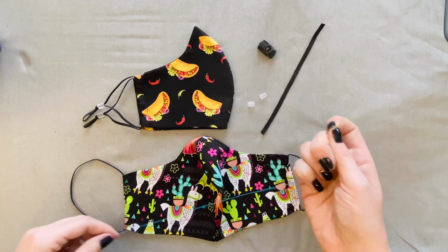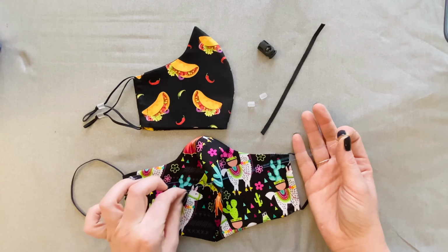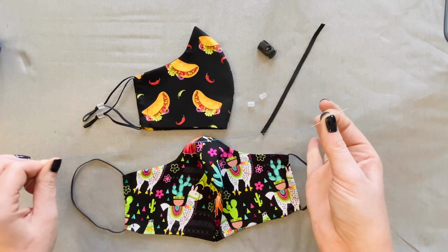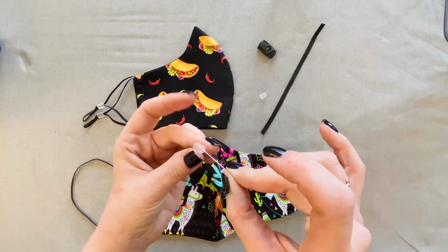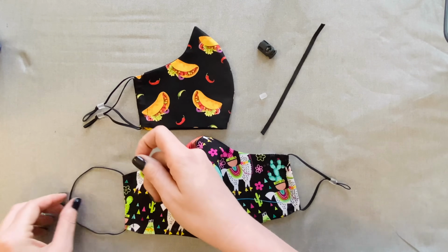Now, to attach the adjuster, you are going to need a needle and thread. It doesn't need to be knotted. You're not actually sewing anything. You're just using this to get the adjuster on. I am going to go into the adjuster in the small end, like this, going through. I'm coming over to my loop.